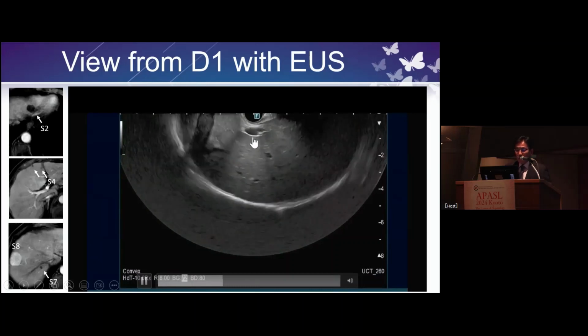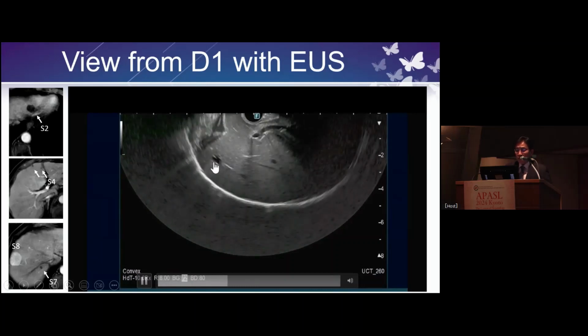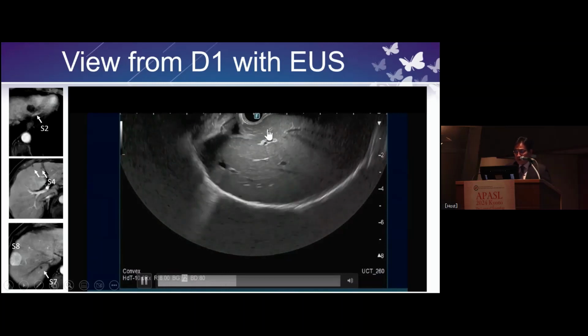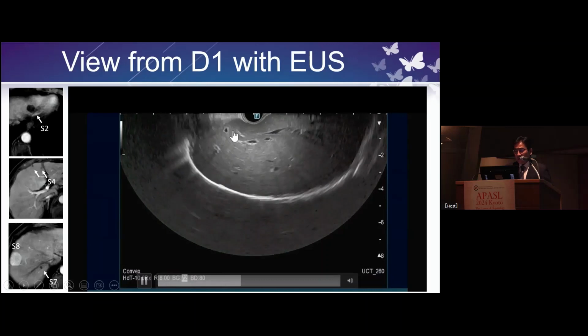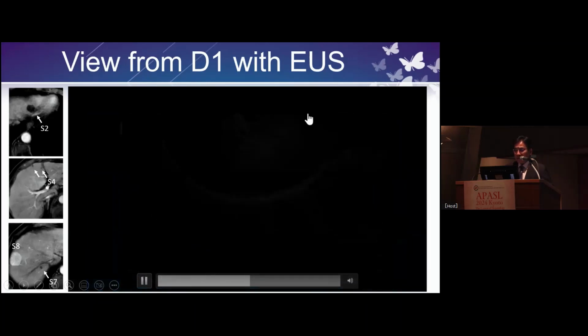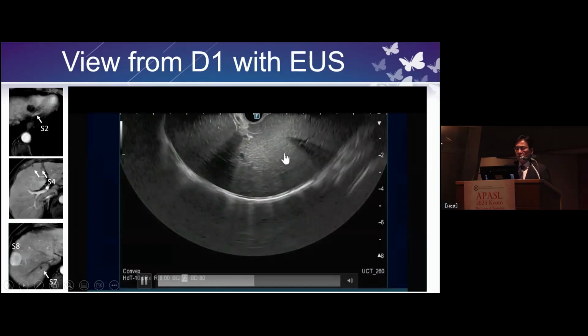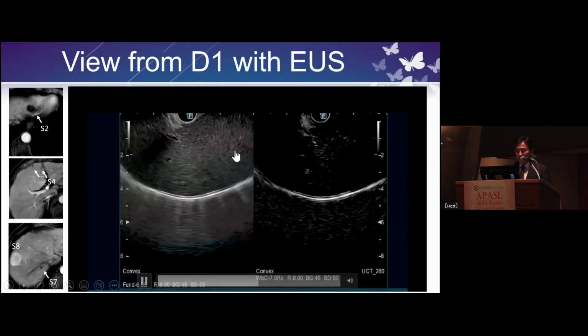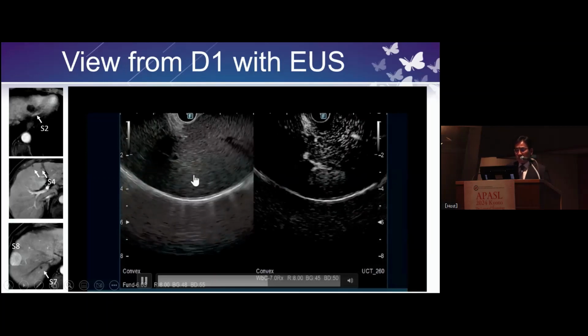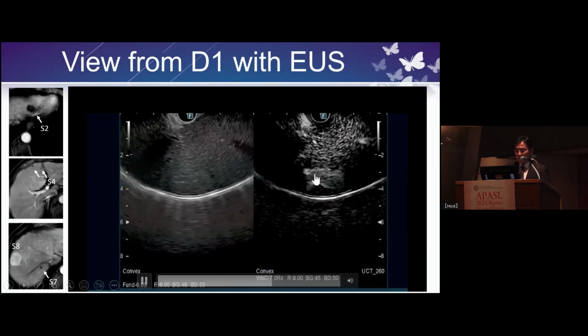And then I follow the posterior. You can see the segment 7 cyst. This is P7, P6, and the right hepatic vein here. And here is the segment 6. Very easy. So this is the right portal vein. Now I inject contrast medium, Sonazoid. Can you see FNH?